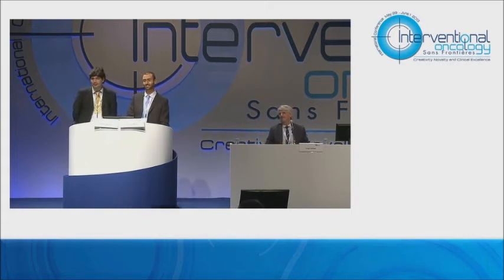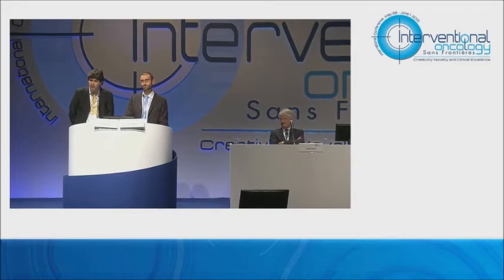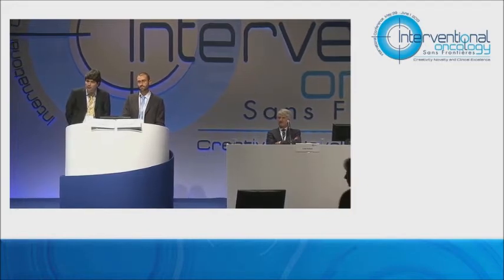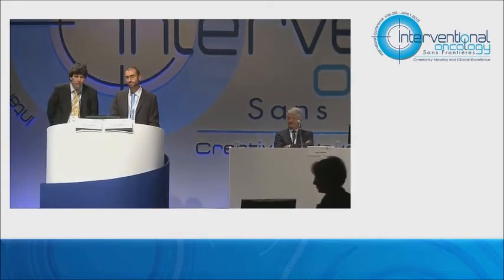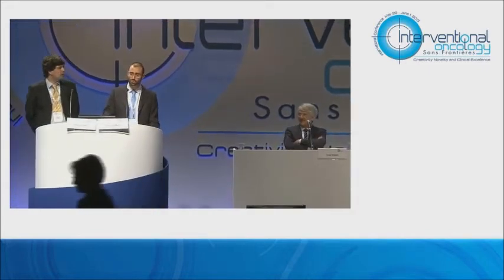Treatment planning is okay with radiofrequency ablation, as we can foresee the necrotic area according to the exposed tip of the needle. But what about treatment planning with microwave ablation? Do you mean for the dimensions of the ablation? For the size of the ablation?